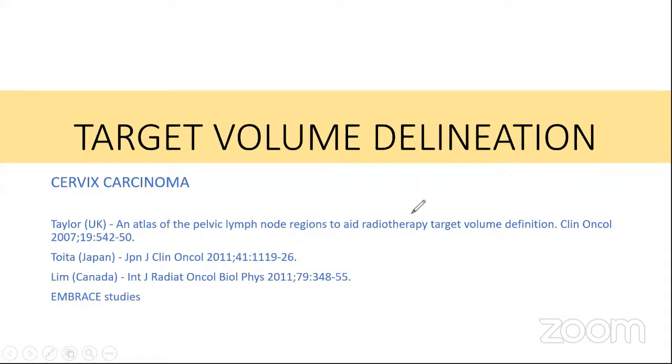So coming on to the target volume delineation principles, all of my discussion has been derived from the Taylor et al. article in 2007, which gave a general guideline for contouring nodal regions, an article in the Japanese Journal of Clinical Oncology published by Toita, and one from the Red Journal, and of course some information is also taken from the EMBRACE studies.